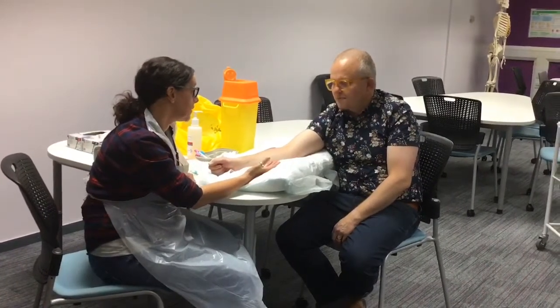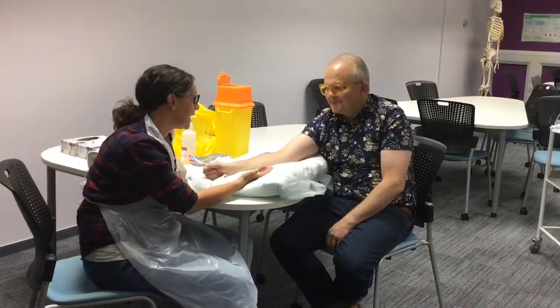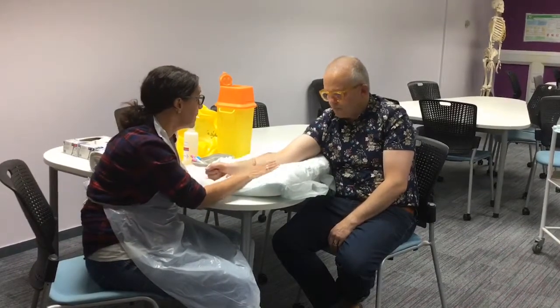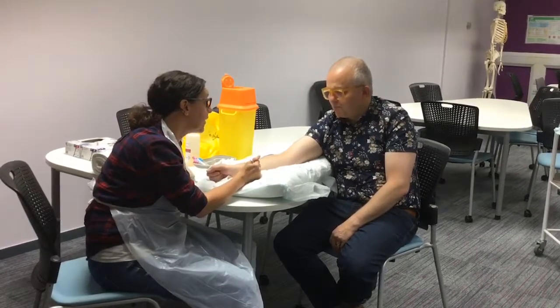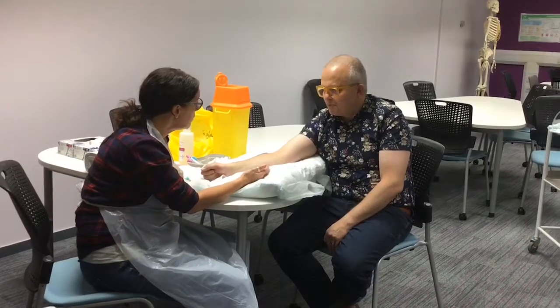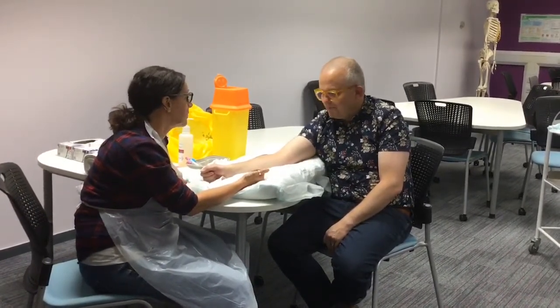If Mark were my patient, I would be explaining what I'm going to do. Thank you for letting me come today. My name's Ari, I'm one of the nurses. What I'm going to do is palpate and feel the veins, and then pop a very small needle in to take some blood — the doctors have asked for some blood tests. Are you all right with that? Do you have a needle phobia or anything I should be aware of? Are you happy for me to go ahead?